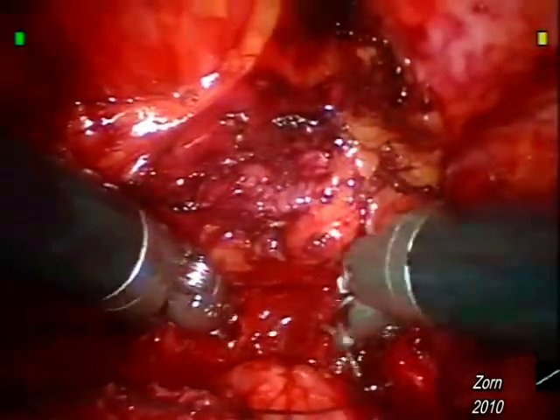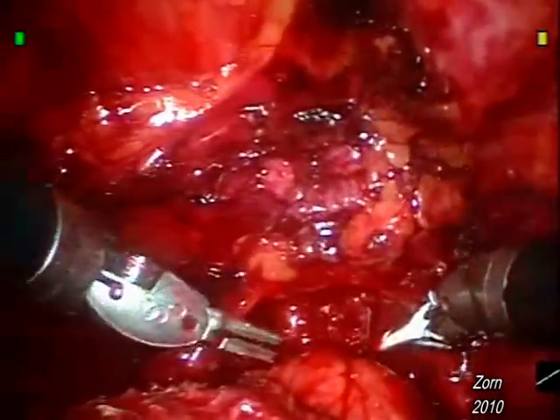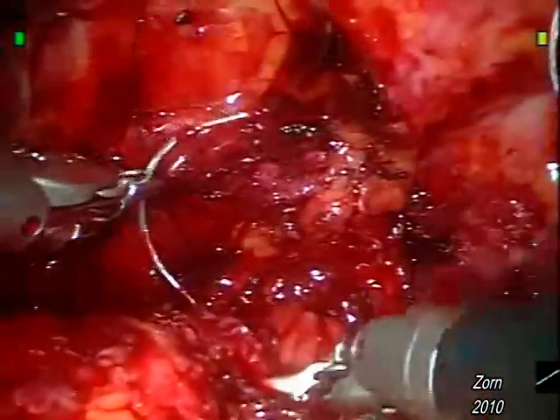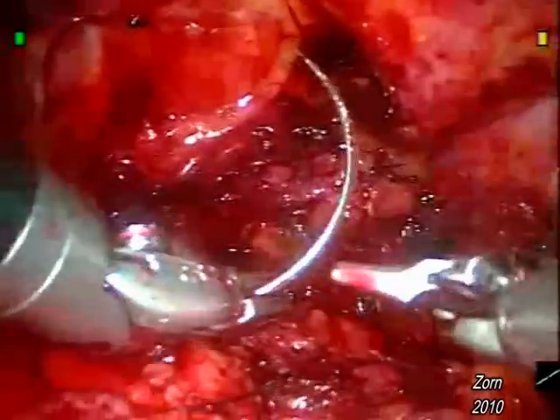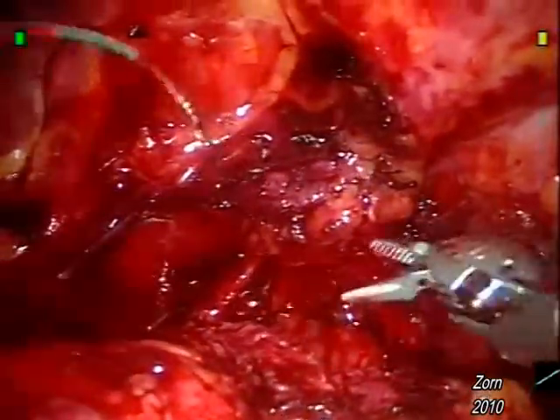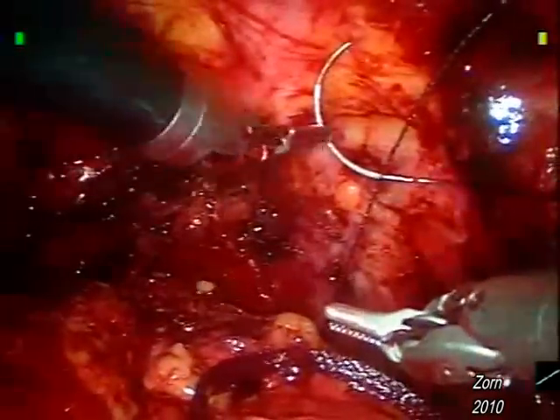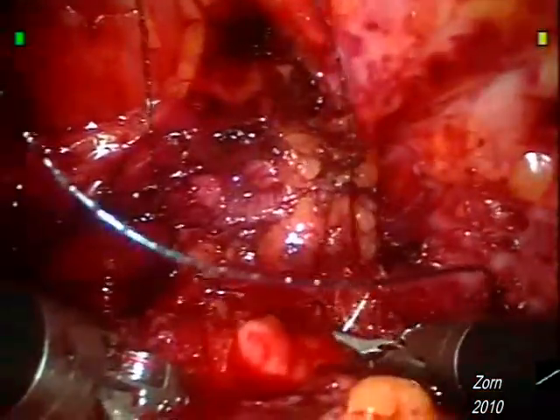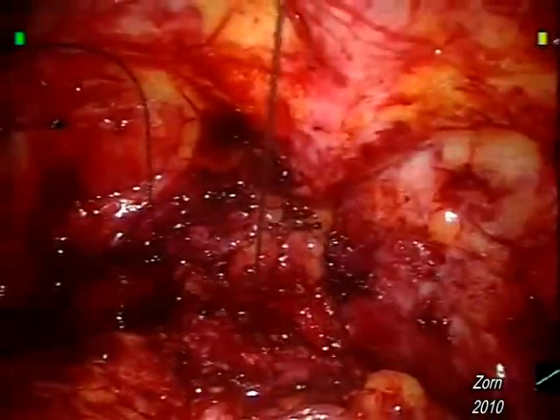What is also advantageous about robotic suturing is the fact that a continuous running suture can be employed. With conventional open surgery, 4 to 5 bites are taken with micro-gaps between those sutures, which require a longer Foley catheterization. This running suture eliminates surgical time and potentially urine leaks. What is also great about the V-Lock suture is that once the desired tension is achieved, there is no further worry that the suture may loosen in the previous bites.